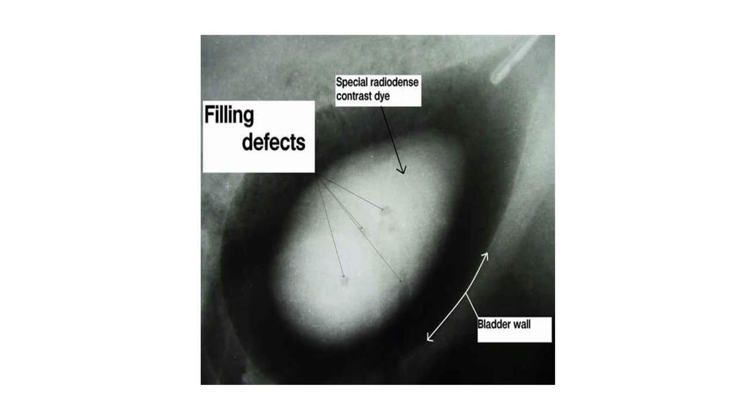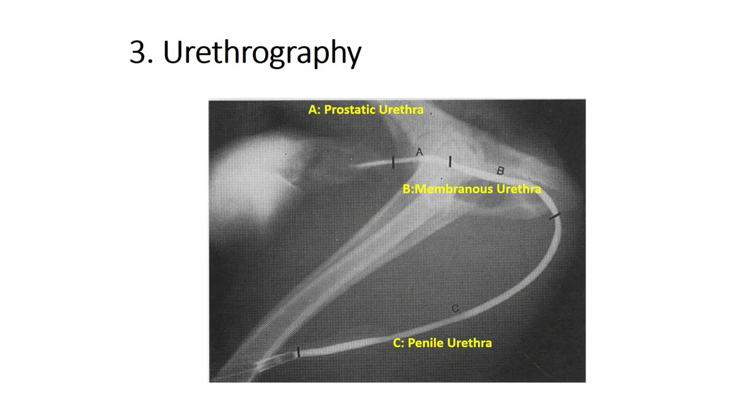In a normal or survey radiograph, the uric acid stones are very difficult to appreciate. So this is an artifact. Sometimes the air may get trapped in between the positive contrast, causing this filling defect. So this may always cause confusion with bladder stones.